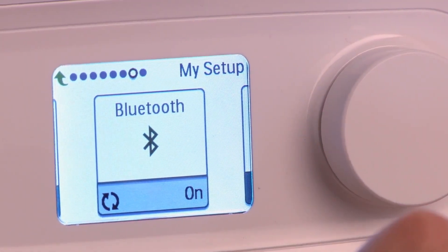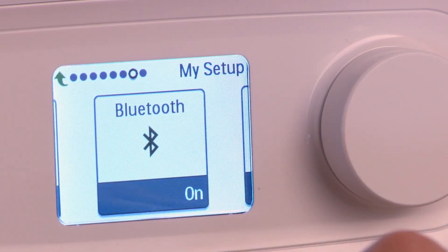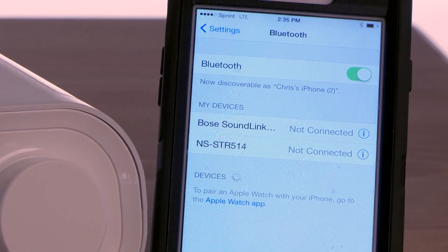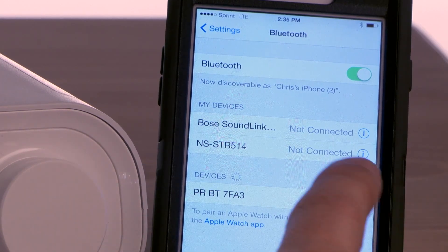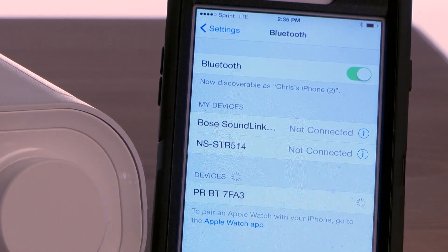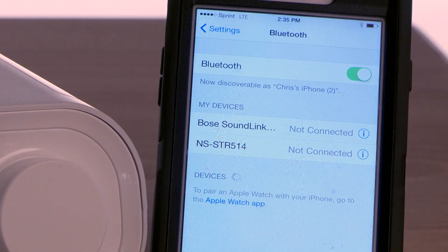Once Bluetooth is on, press the control knob again. Return to the Bluetooth settings on your mobile device. DreamStation now appears in your settings with a name beginning with PRBT, followed by four characters unique to your device. Select that name. If DreamStation does not appear in the menu, repeat the procedure to verify that Bluetooth is turned on.